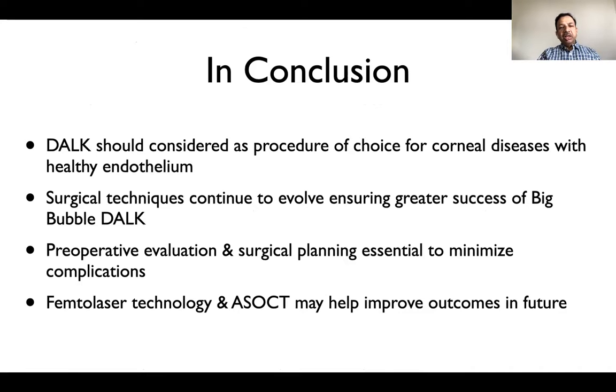So in conclusion, DALK should be considered as a procedure of choice for corneal diseases with healthy endothelium. Surgical techniques continue to evolve, ensuring greater success of big bubble DALK. Pre-op evaluation and surgical planning is essential to minimize complications. In future, femtosecond laser technology and integrated anterior segment OCT may help improve outcomes.